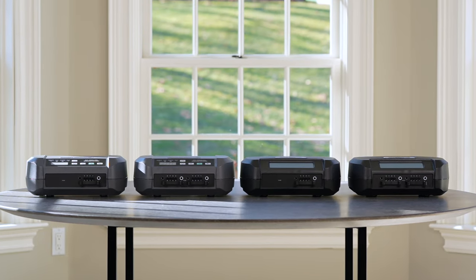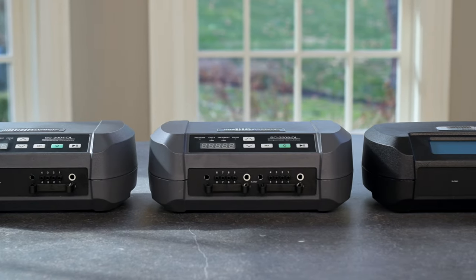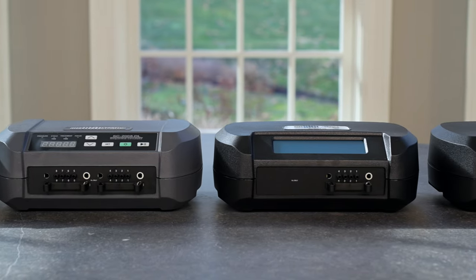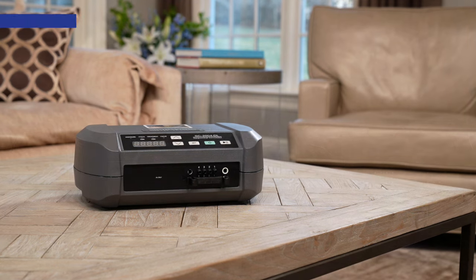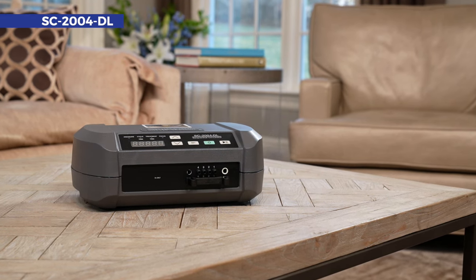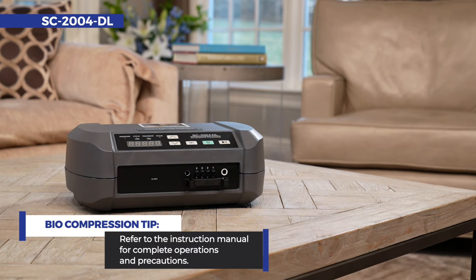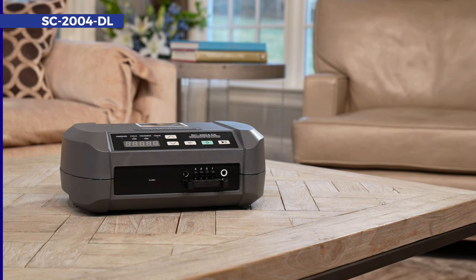Your physician has prescribed a biocompression sequential circulator for your treatment. All of our pumps are designed for home or hospital use. This video will guide you through the setup of the four-chamber sequential circulator SC2004DL from start to finish. Always reference the instruction manual for a complete understanding of operations and precautions for your pump and garment. Let's get started.